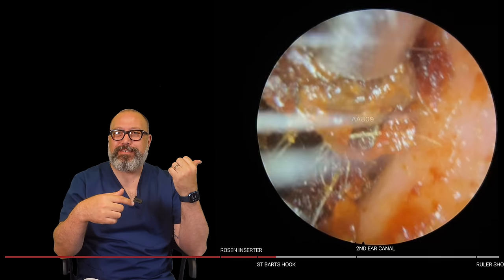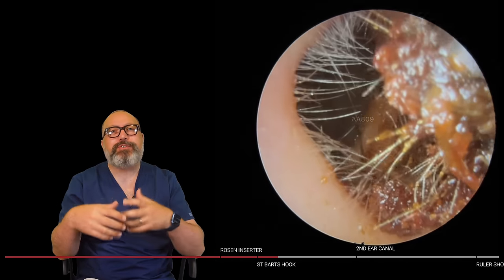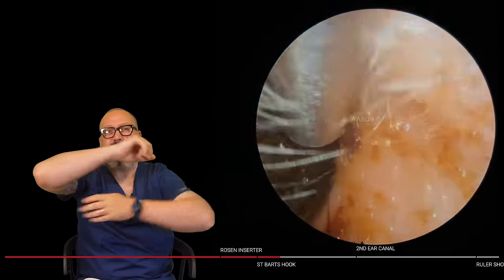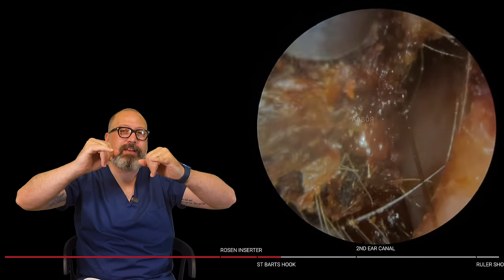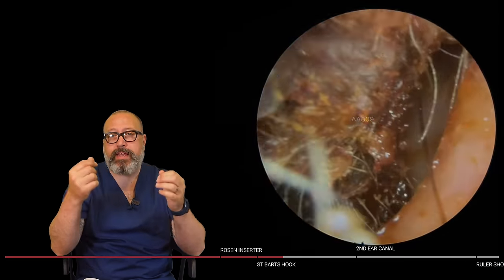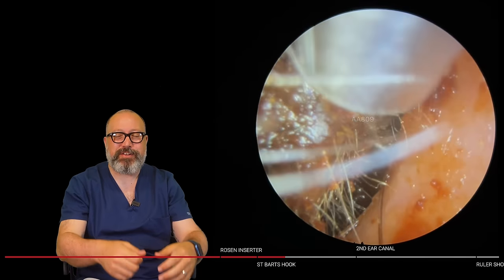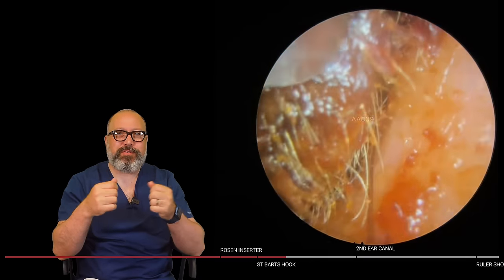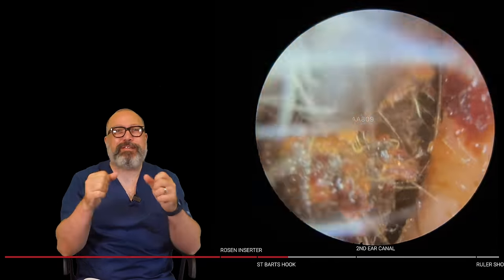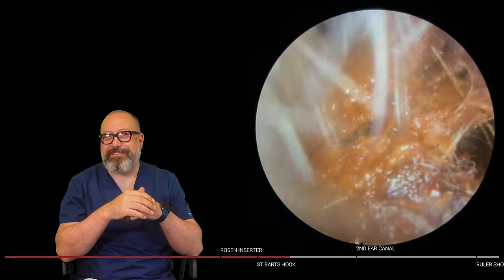Somebody said in the comments on the video I put on about the teenagers' wax, all your arms must be aching. Do you know what they do? Because you are literally holding a brace, you're not resting on anything, so you're bracing there all the time. So your arms are up in this direction all the time. And they're only getting any rest really when you take whatever it is out of the ear canal, taking it off the end of the suction. So sometimes I will chat to the patient and drop my arms down just to let the blood flow back to my fingers for a little bit before we carry on. So yeah, trick of the trade there, guys, if you ever see us doing that.